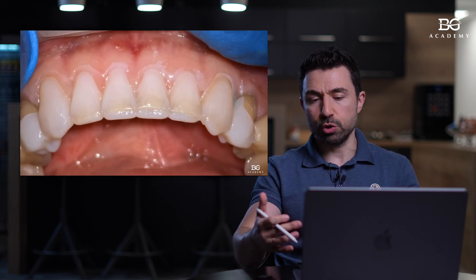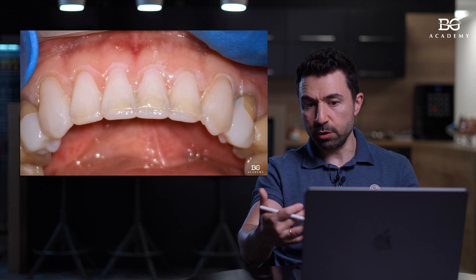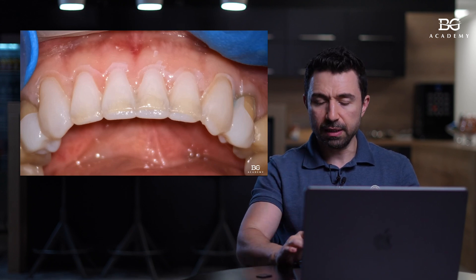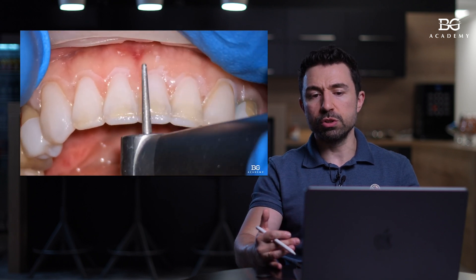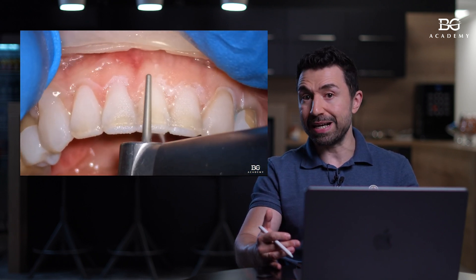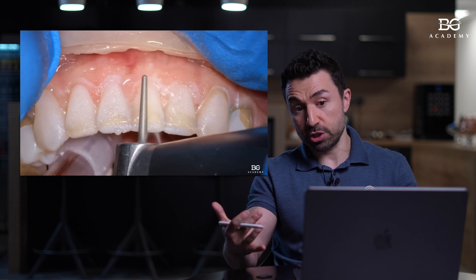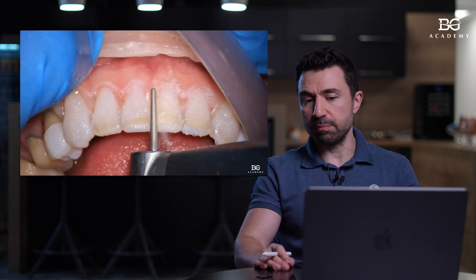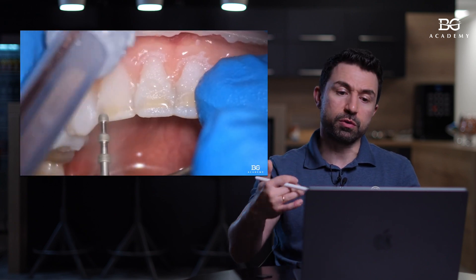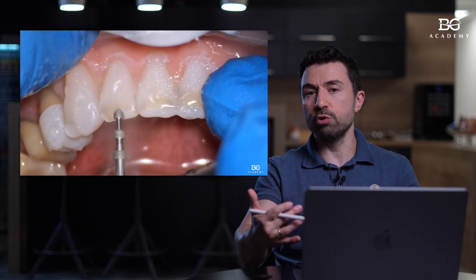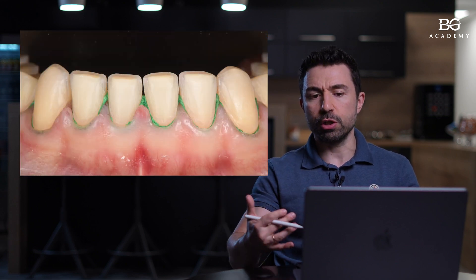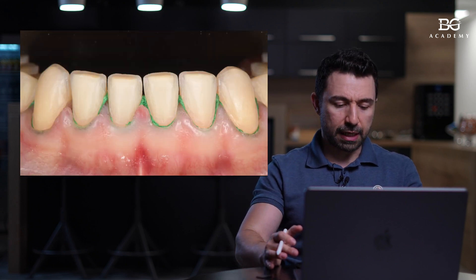This is how it looks on the video. We provided a mock-up, and you can see exactly how these exposed teeth look. We use a bore to do equilibration or pre-cut initial preparation until the level of the mock-up — that's the important part, that's our zero position. From the zero position, we have to give space to our dental technician, so we use a depth cutter. The size of the depth cutter we select according to the space we need to give to the dental technician.